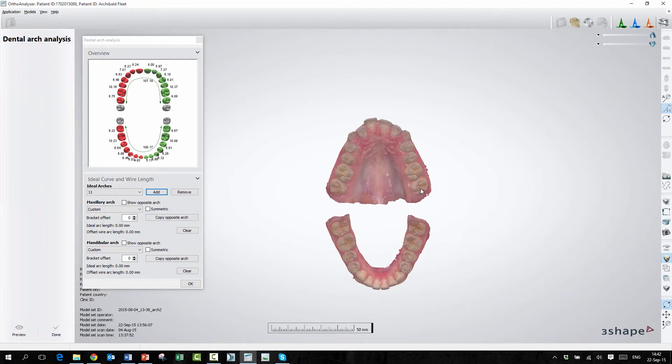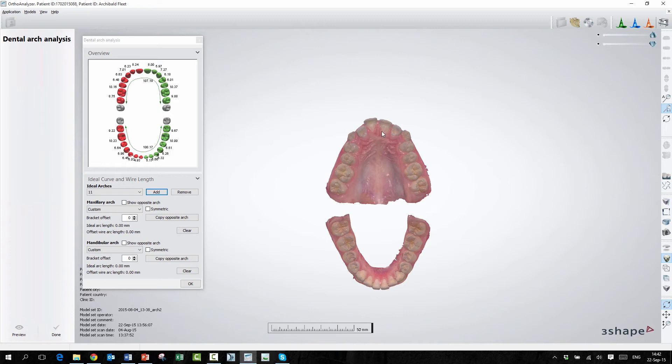It's if you have a specific arch you want to choose. So you can also use this feature if you want to measure which size is the right arch, or is it small, medium, or large, or do you have a specific curve that you want to use for this patient?